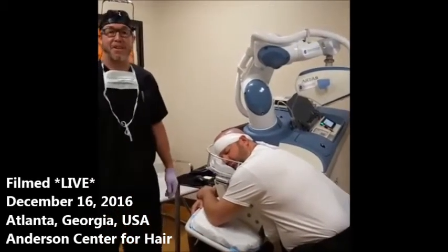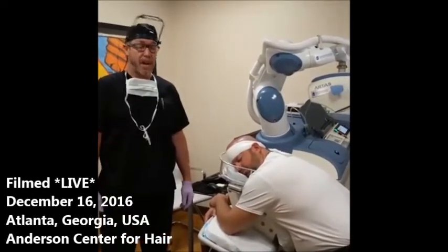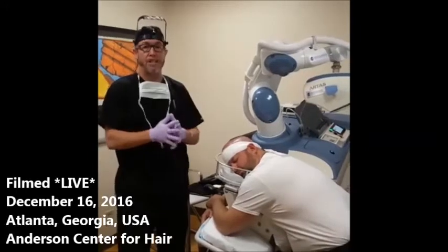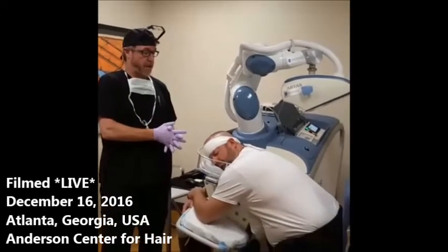Good morning, my name is Dr. Ken Anderson, and we're here at the Anderson Center for Hair. We are live, and I'm going to talk a bit about how we start our robotic surgical procedures. We're here with our patient, Jason.